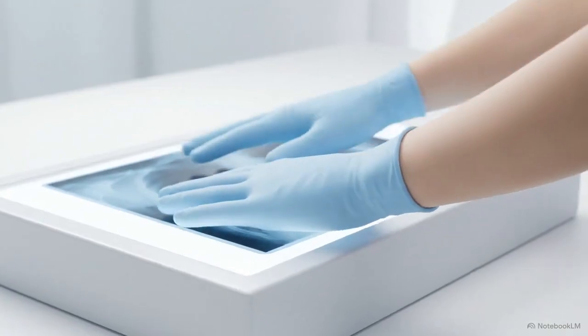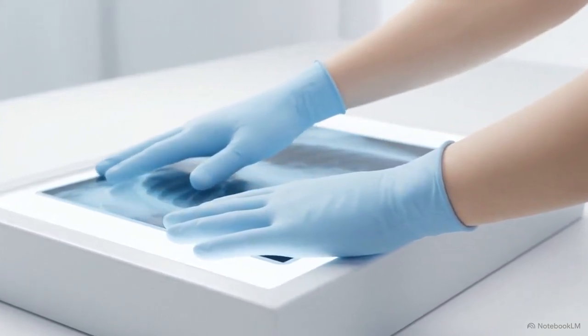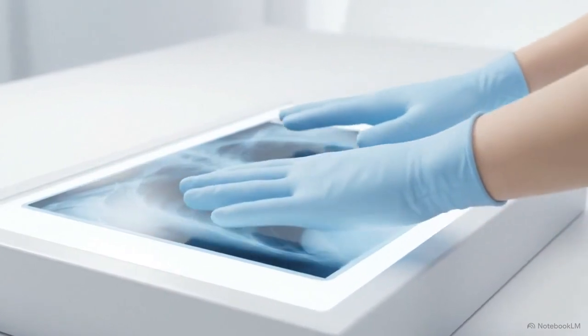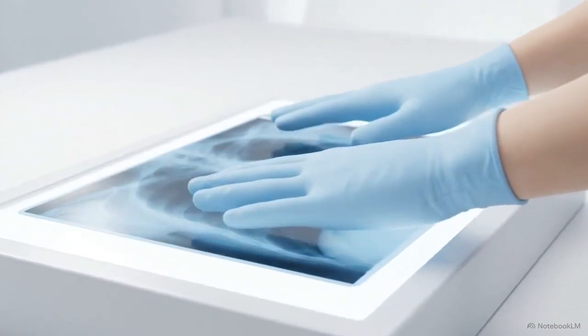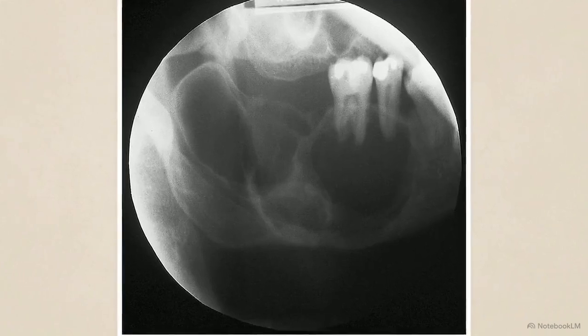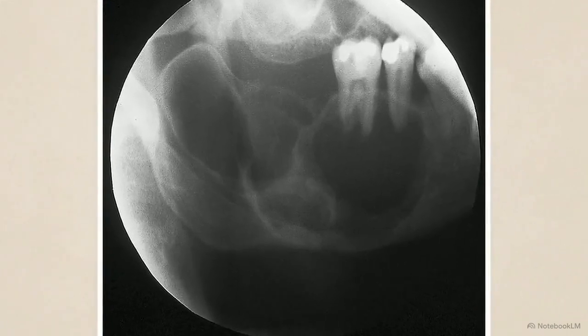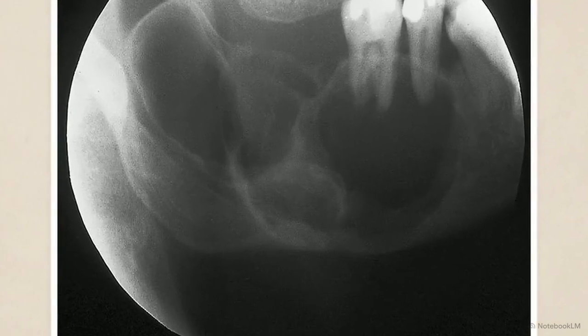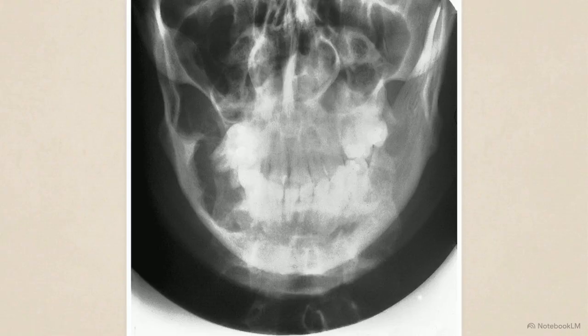While the patient's demographics and physical characteristics provide a baseline, definitive diagnostic work begins with a rigorous interrogation of the radiographic evidence. This initial oblique lateral radiograph provides a broad view of the lesion. We can observe a large multilocular radiolucency occupying the posterior mandible. By examining the posterior anterior, or PA view, we can assess the degree of medial lateral expansion. There is significant expansion on the right side, which is beginning to disrupt the typical symmetry of the facial skeleton.